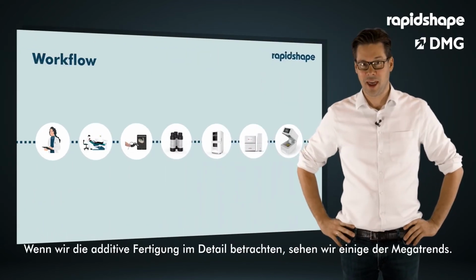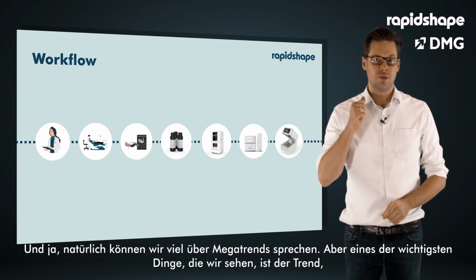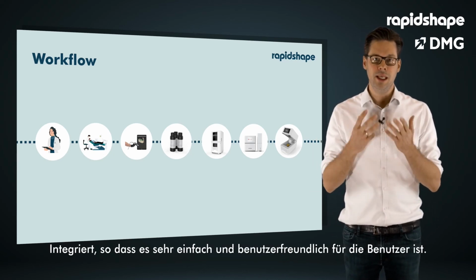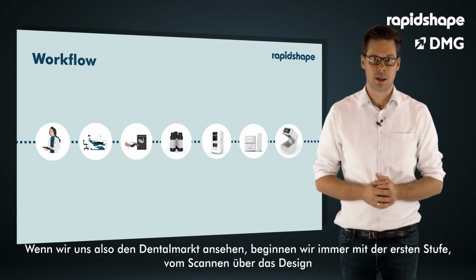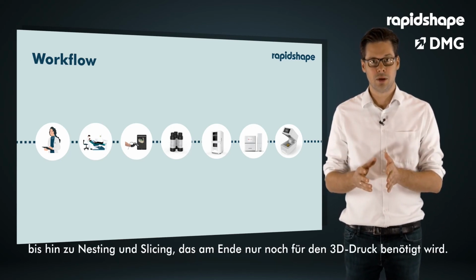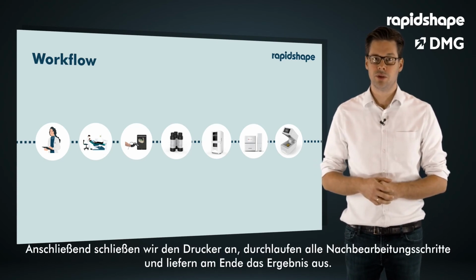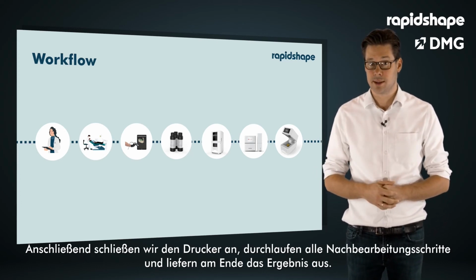Looking into additive manufacturing in detail, we see some of the megatrends. And yes, certainly we can talk a lot about megatrends. But one of the key things that we see is a trend to go end-to-end over the complete workflow, integrated, making it very easy and usable for the users. So having a look into the dental market, we always start with the patient, going from scanning to the design to some kind of nesting and slicing, which is just needed to at the end 3D print, then connecting to the 3D printer, then going through all the post-processing steps, and then at the end delivering the result.